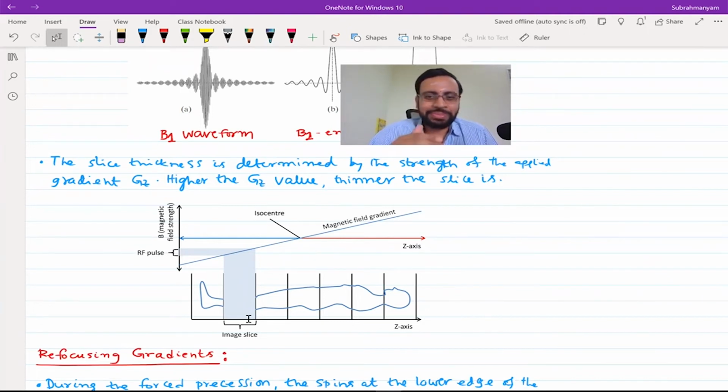I can afford to pause here. If you have some questions, there is absolutely no problem. Sir, there are two factors that you want to fix, that is Z and omega, to image a particular region, right? Right. So the Z parameter is controlled by the gradient magnetic field, the delta Z, and omega is controlled by the frequency of the RF pulse. Right.